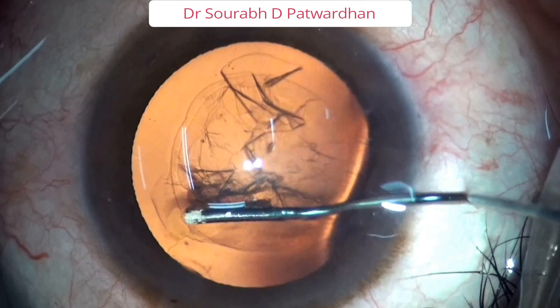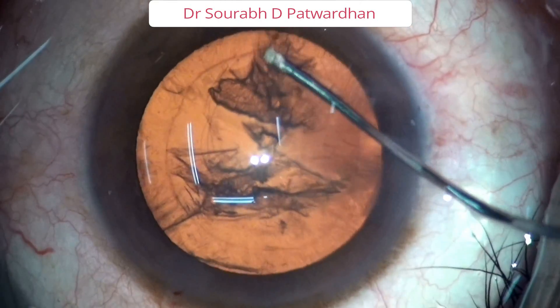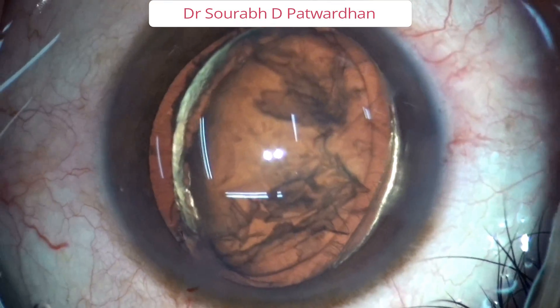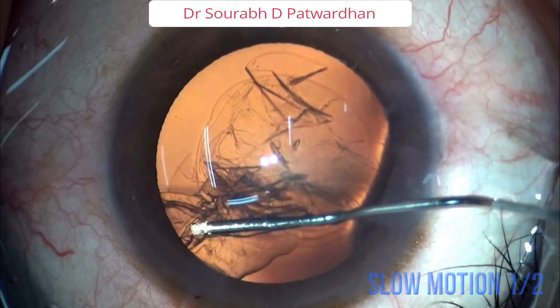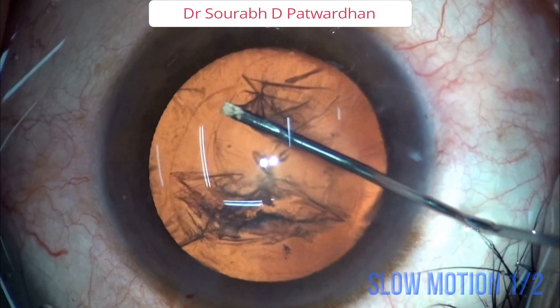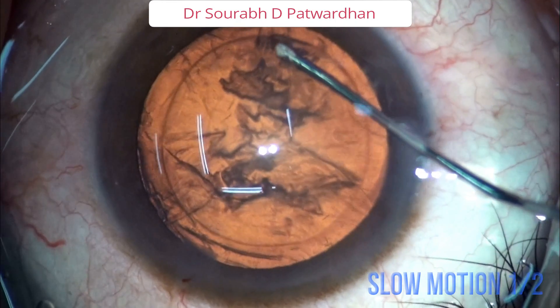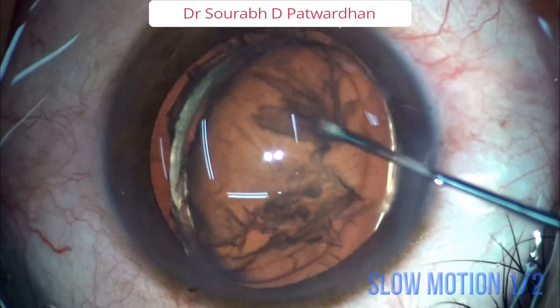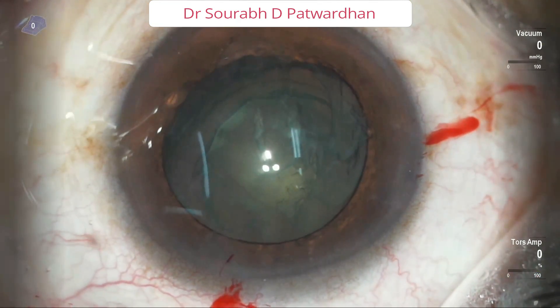In this case again, hydrodissection is done — cortex cleaving, which is very important. And just by pushing more fluid gently inside the bag, one pole is prolapsed out. Cortex cleaving hydrodissection is a very important step. Then gently push fluid from one corner, keep gently pushing it, so one pole prolapses out. It is important to push the fluid gently.